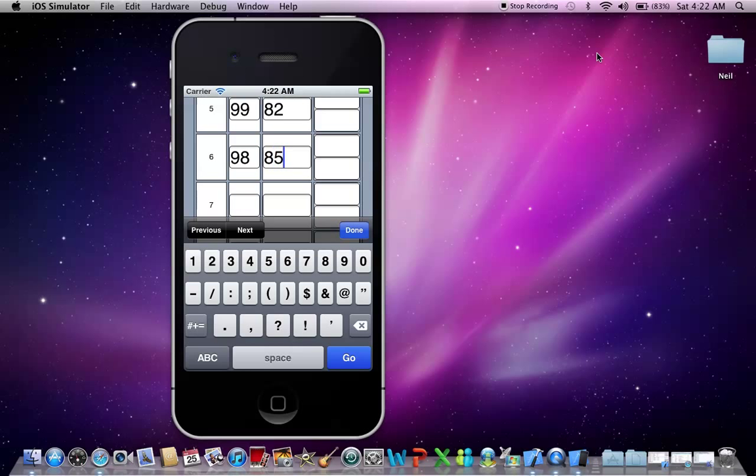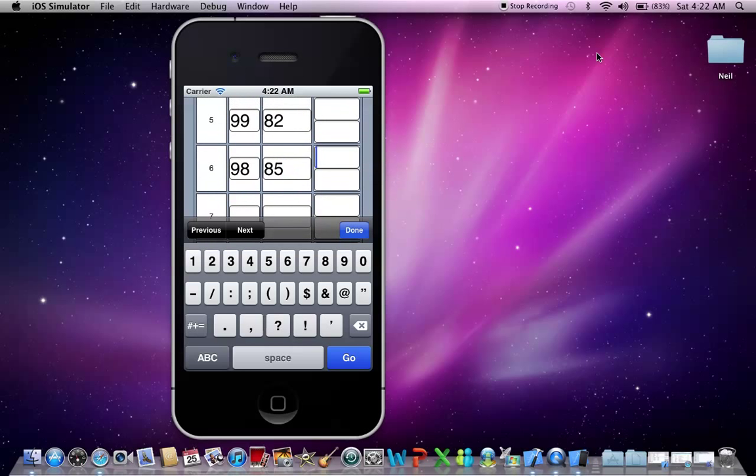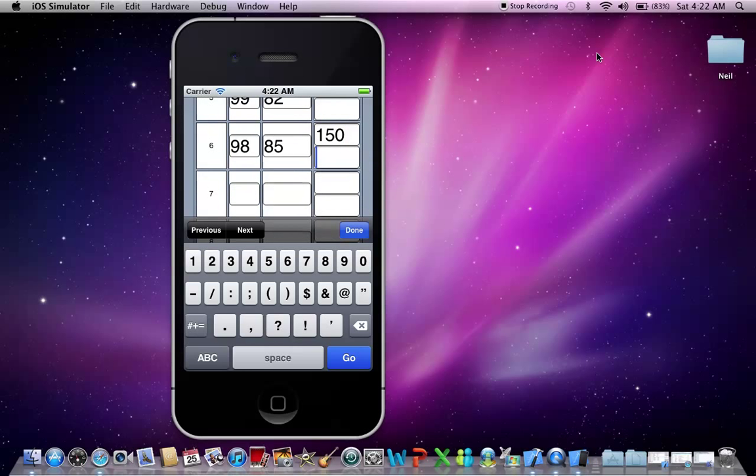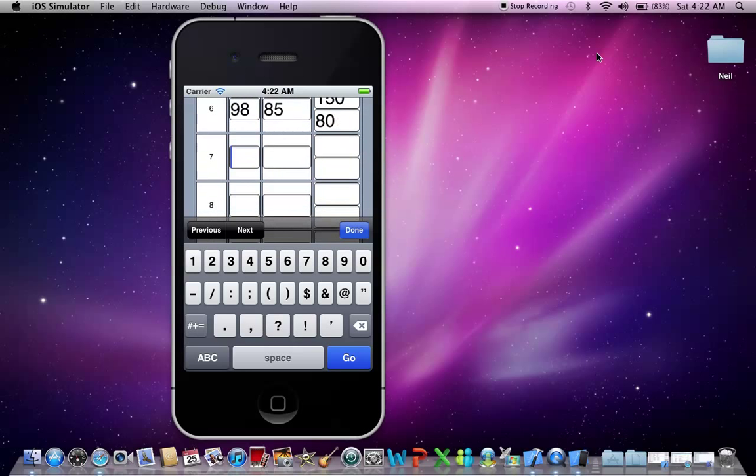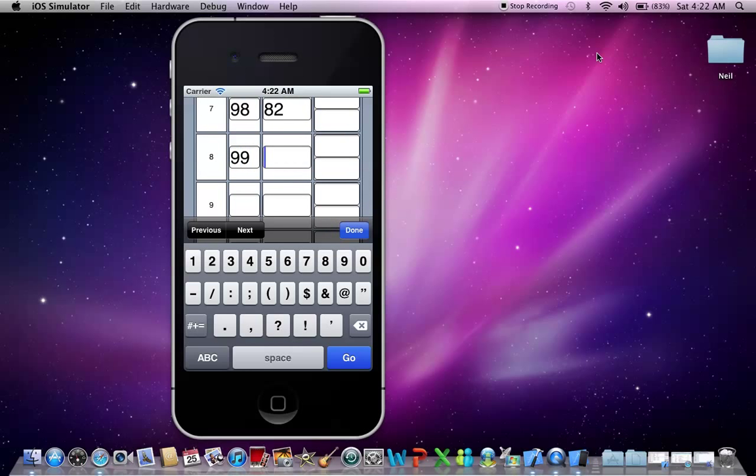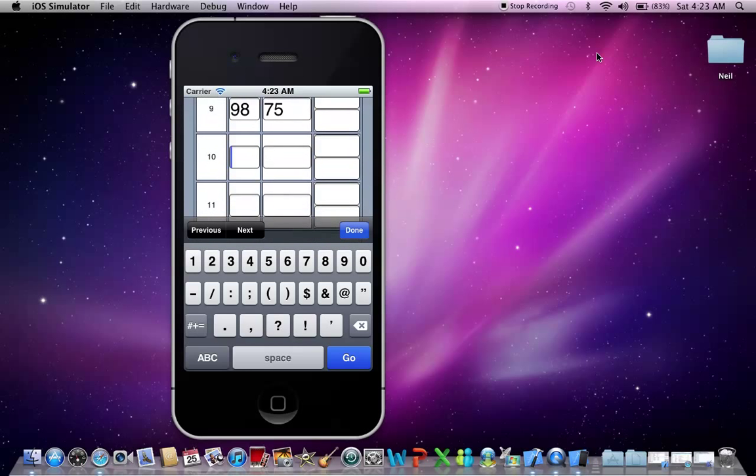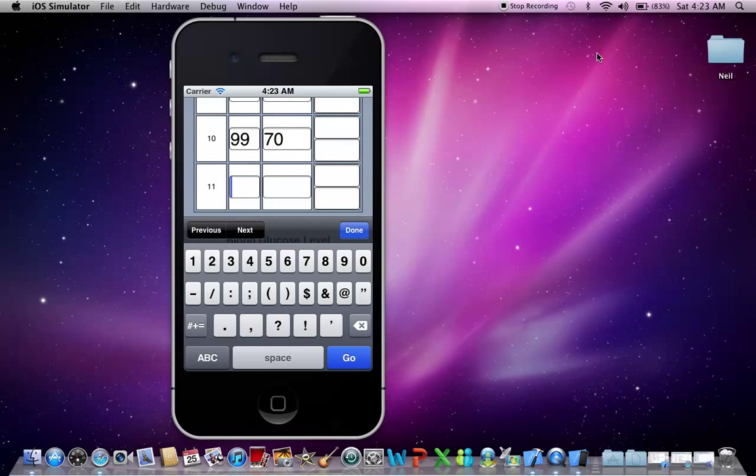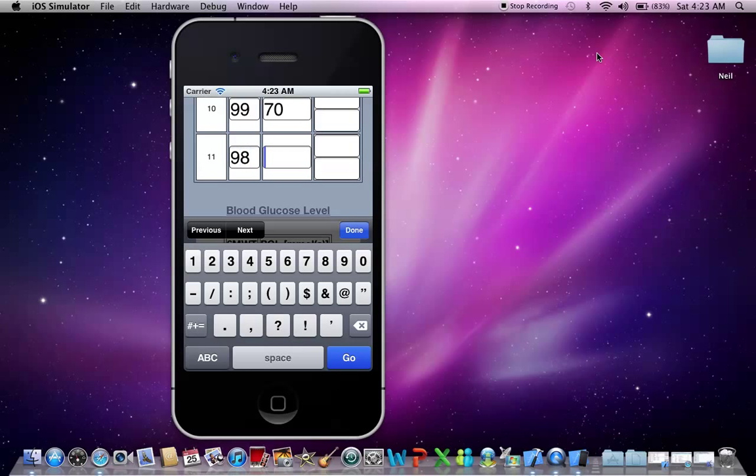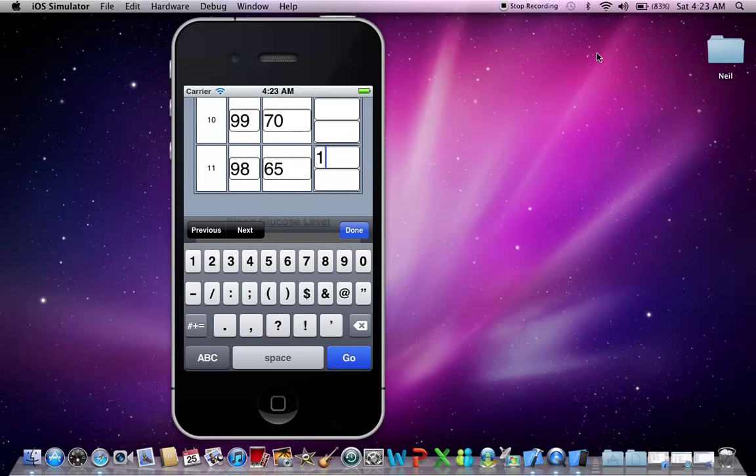Now it's the sixth minute, so usually you would do a blood pressure here. So for example, I'm going to put in 150 over 80. I'm going to continue on with putting in my values for saturations and heart rate. And now it's the last blood pressure as well.